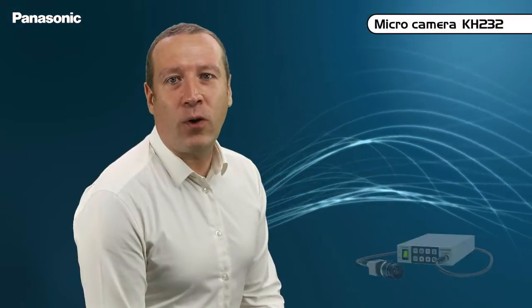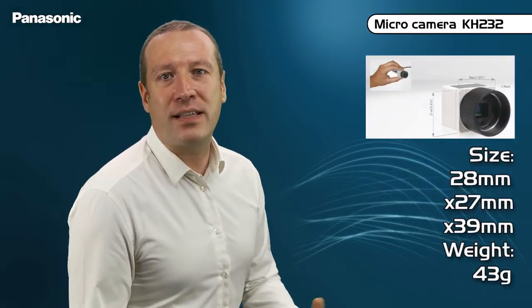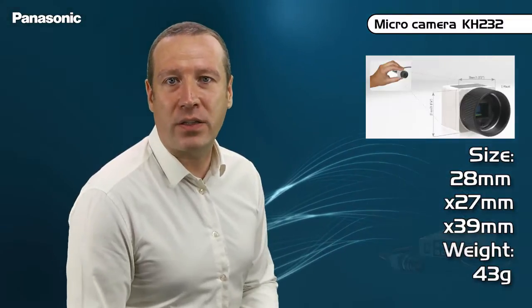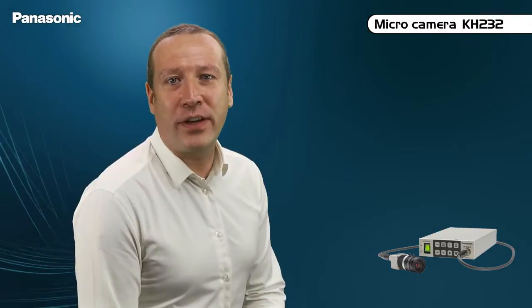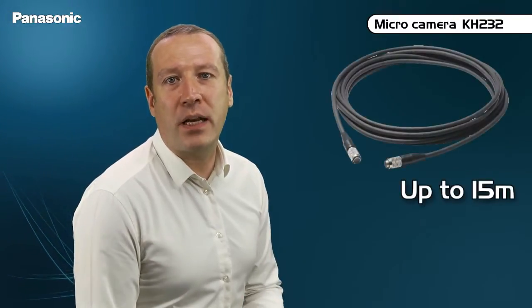The second model is the KH232. This camera head is even more compact and lighter, since it is equipped with a single one-third type MOS sensor, providing a 900 TV lines resolution, while its sensitivity will require more lighting. The KH232 is linked to its very compact control unit with a cable up to 15 meters long.